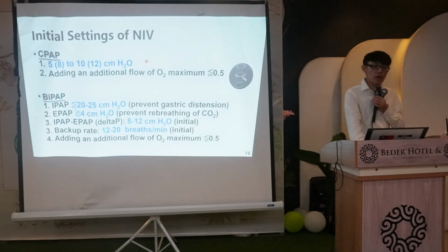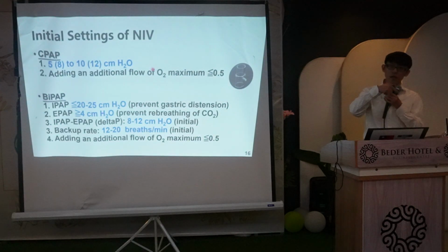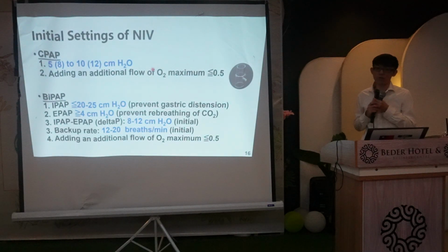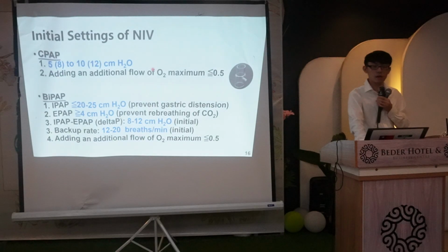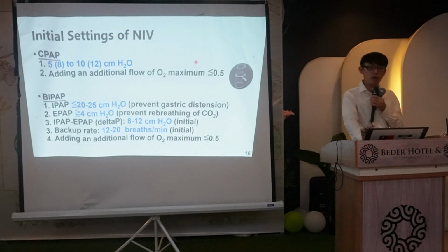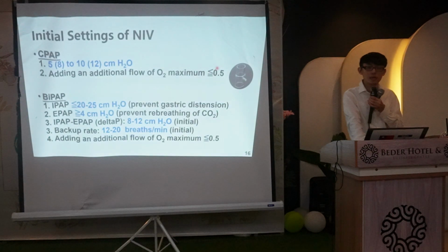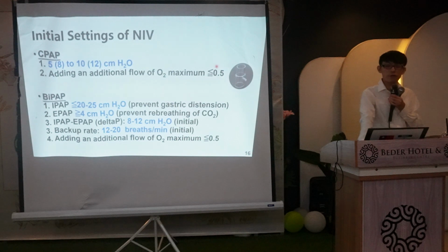I already told you that because the O2 flow is added into the breathing circuit, the maximum FiO2, fraction of inspired oxygen, is quite low. It's less than 50%.